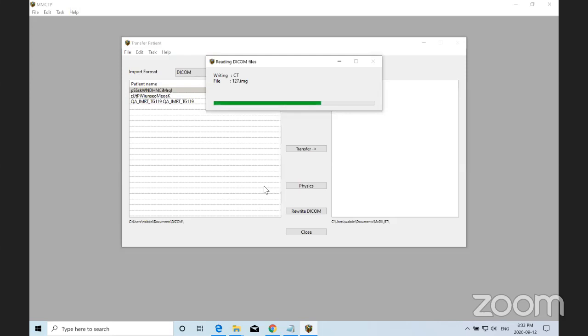Well, it will calculate it properly if you're treating it very similar to the jaws on a Varian Linac, in the sense that you can apply the same calculations to determine divergence on any set of jaws. So if we have two component modules of jaws defined on the beam, MMCTP can handle that? It wouldn't be able to handle it without some modifications.